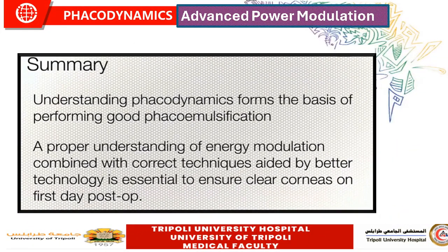To summarize this part of the lecture, we have spoken about the power and the power modulation. The understanding of the phacodynamics of the power delivery and the power modulation is very important to offer you a very clear cornea immediately after the operation.